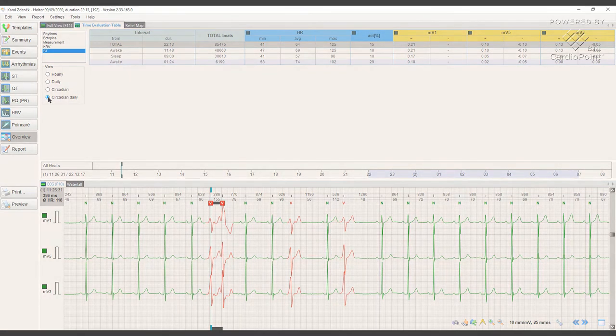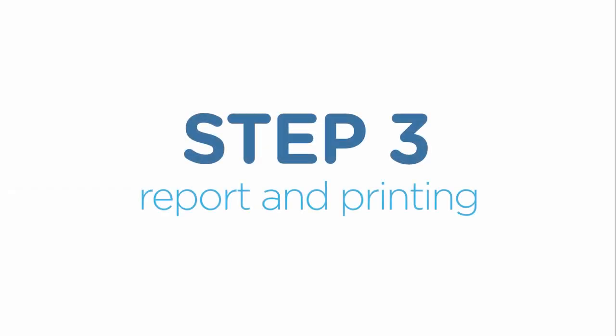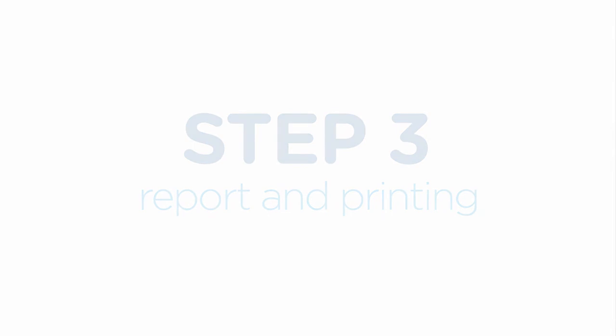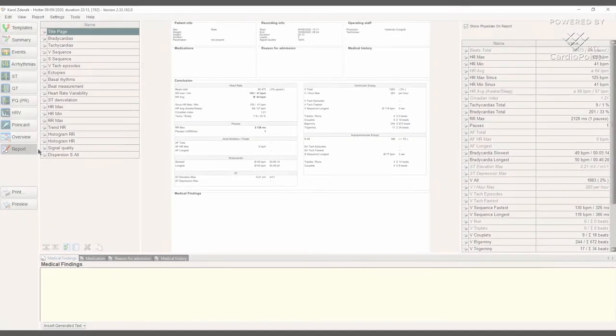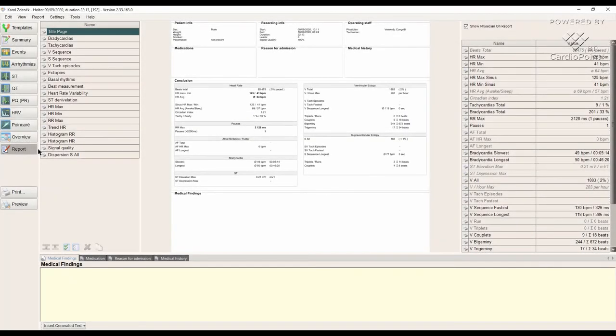Now the last, third step of our analysis, report and printing. Here we will set up the final report for our Holter examination.